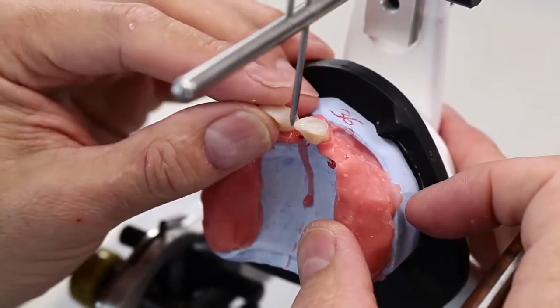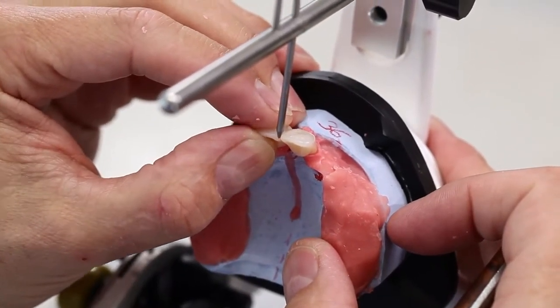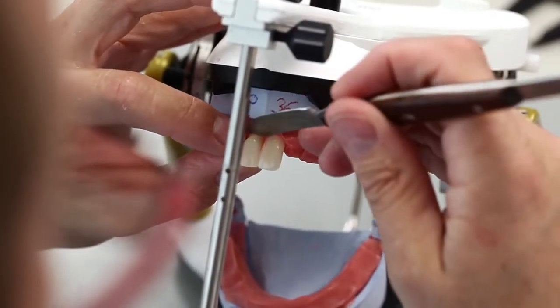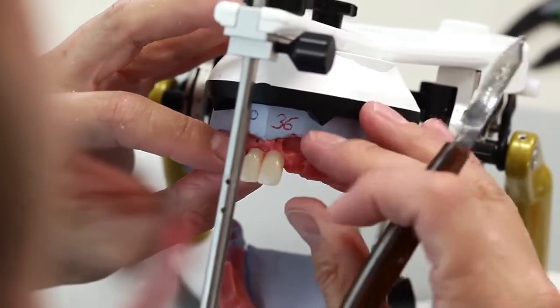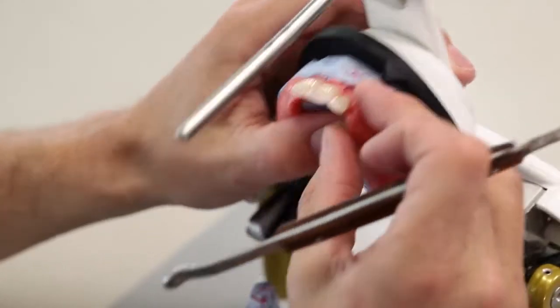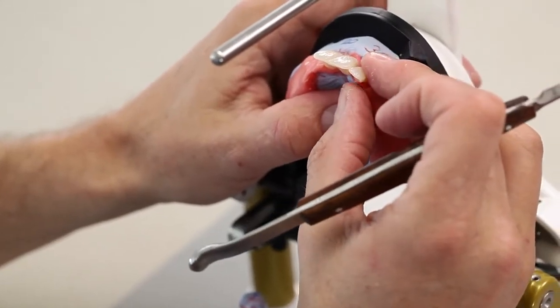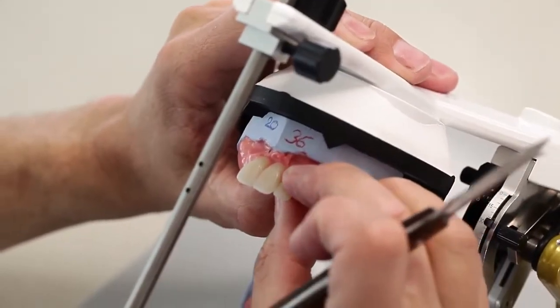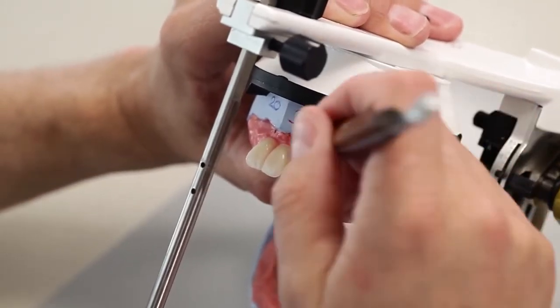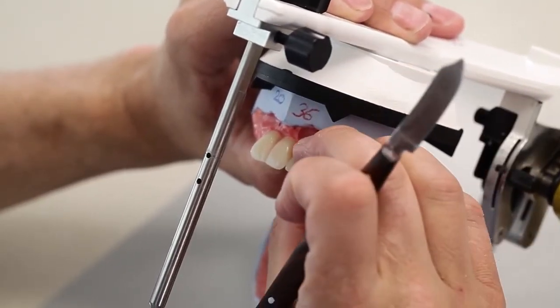Align the 2 central incisors mesially towards the midline. The central incisors are set up perpendicular, the lateral incisors are set up slightly inclined towards the mesial aspect. Usually, the maxillary incisors point toward the lower mucolabial fold in a bow direction. Their labial curvature harmoniously blends in with the vertical anterior tooth arch.